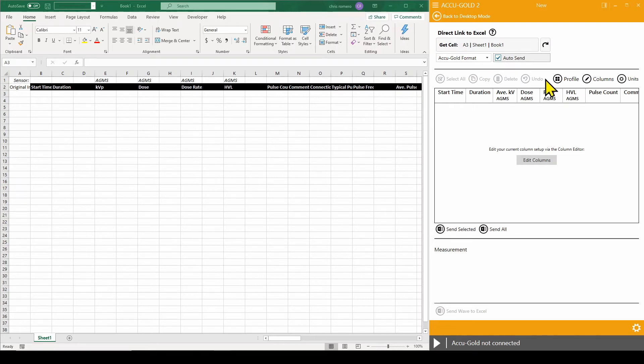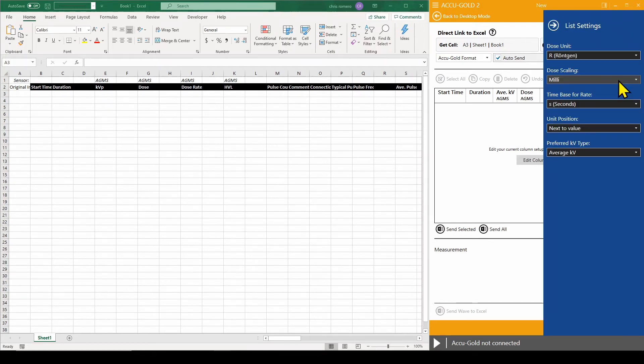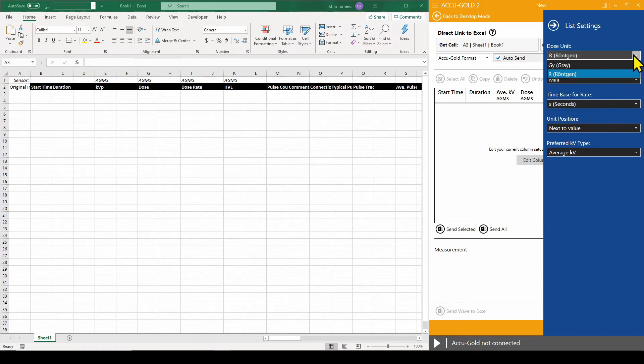The unit of measure cannot be adjusted for data that has been exported. They can be manually adjusted using the setting options. Here we can set the DOSE and the DOSE SCALE unit of measure.